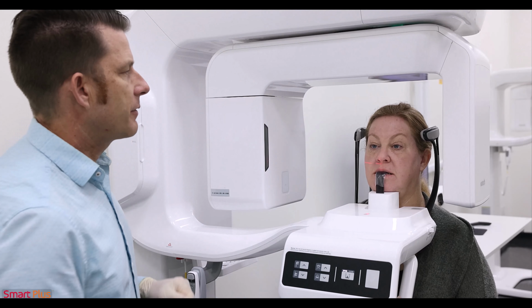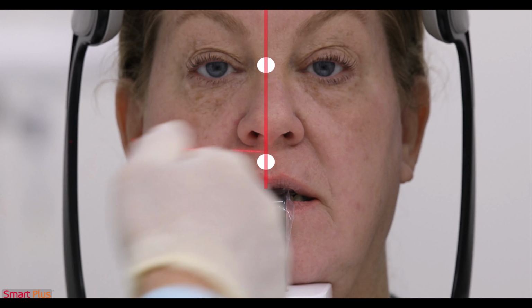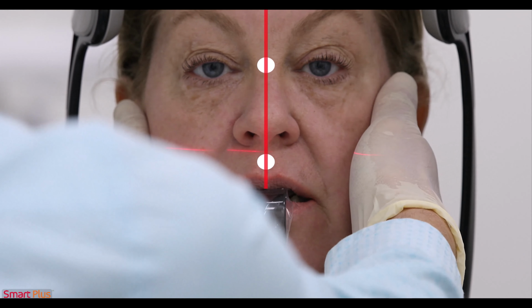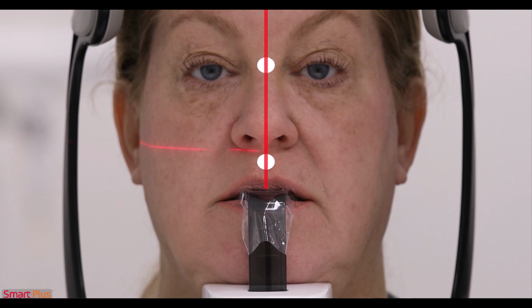There are 2 points of reference. I want to make sure it's right between the eyes and right here through the philtrum. So I'm just going to gently move the patient's head, and we can see that now the line is lined up right through the center of the patient's face.